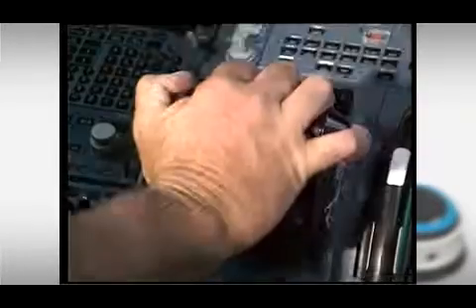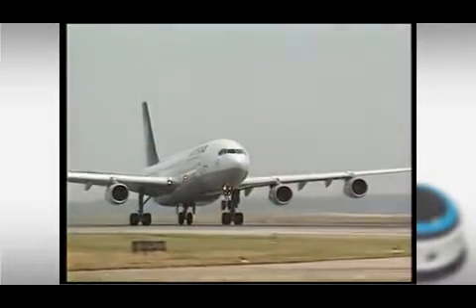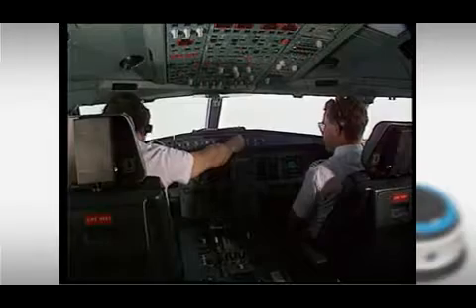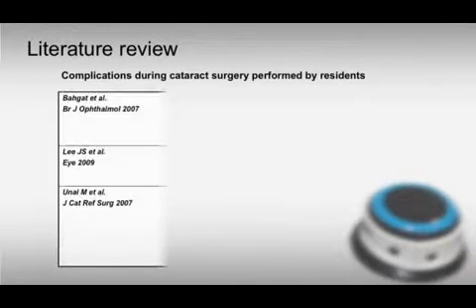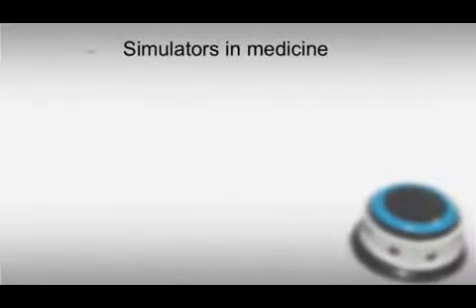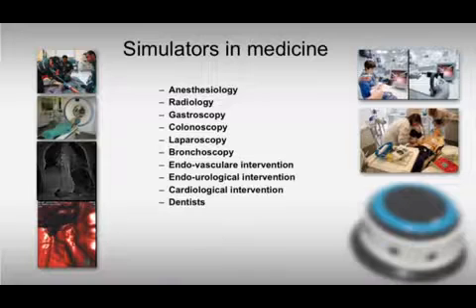The aviation industry established simulators and certified training programs to improve pilot skills many years ago. Today, aviation is the safest means of transportation. Several studies have shown that the surgical complication rate is higher in groups of young ophthalmologists. Different medical and surgical specialties have already acquired experience with clinical simulators.